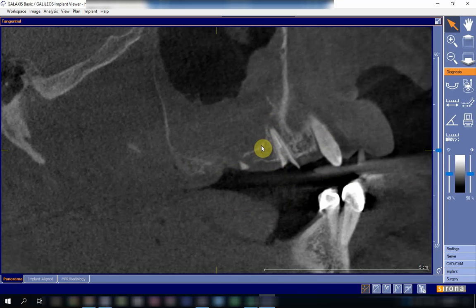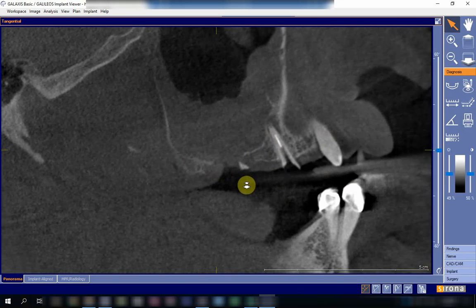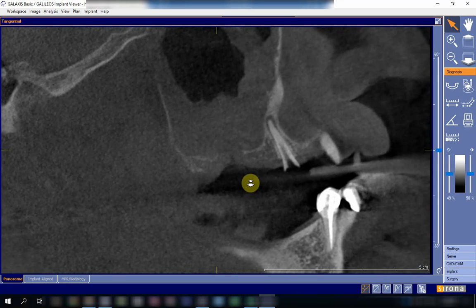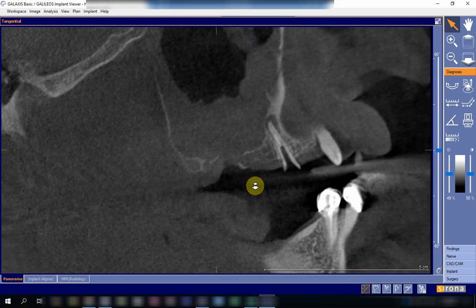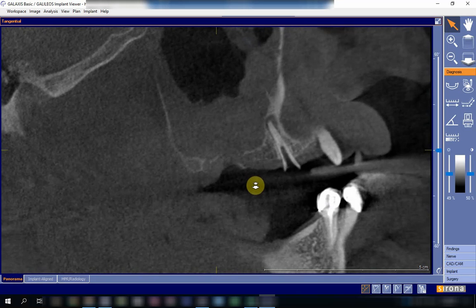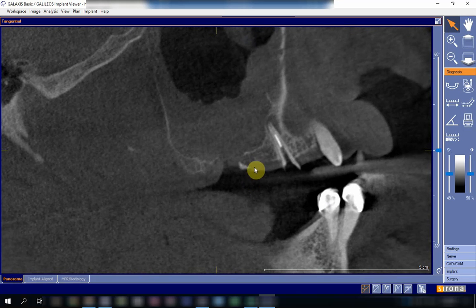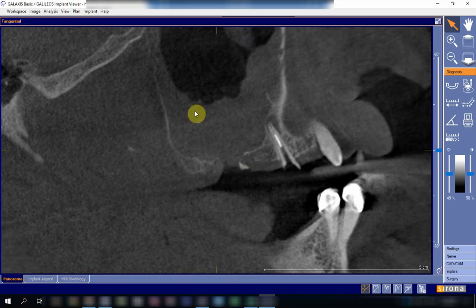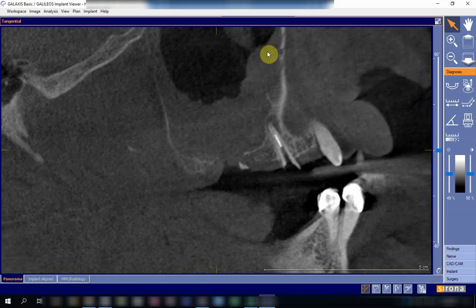If we follow the floor of the maxillary sinus, which appears as a thin continuous line, we can see that in this region there is no more bone — there is a breach, a discontinuity, a breakage of the floor of the sinus. You can also see a trace of bone, a foreign body, or a piece of root which remains here. Thankfully it is still in the bone and has not gone into the maxillary sinus.